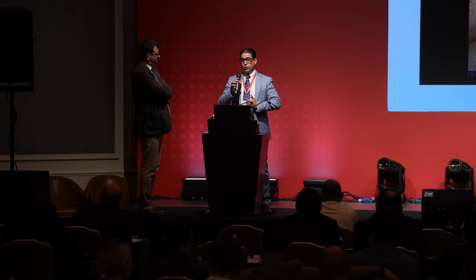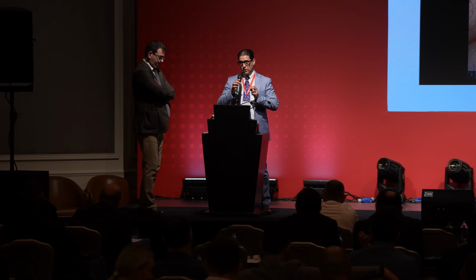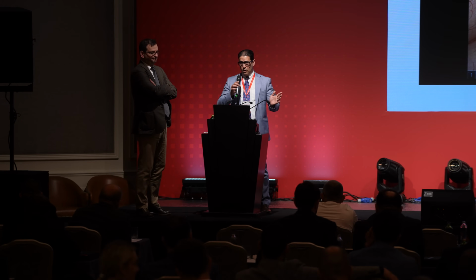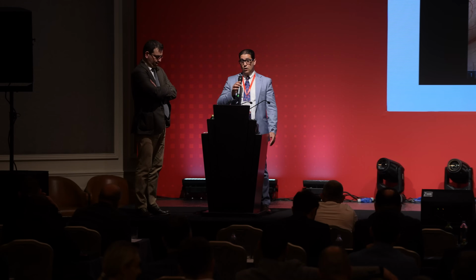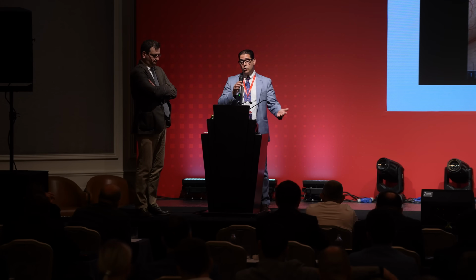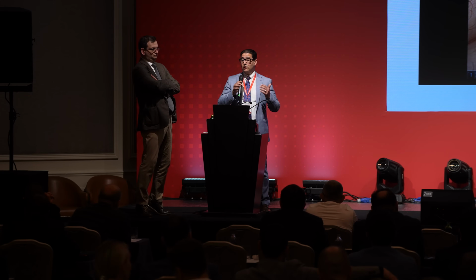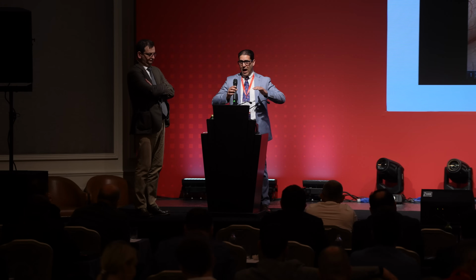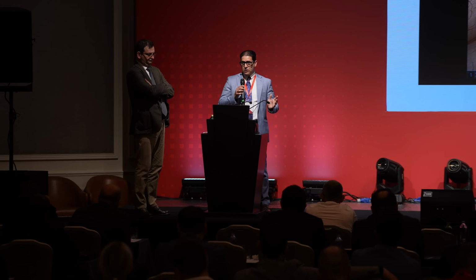You don't have to do it open. It depends on your comfort level and your expertise with using the robot. So if you need to operate emergently, yes, you can do that. If you need to operate emergently on an obstructed hernia, yes, you can do that. If you need to operate emergently on a strangulated necrotic hernia, yes, you can do that. It all depends on how comfortably you can drive this vehicle in this environmental situation.